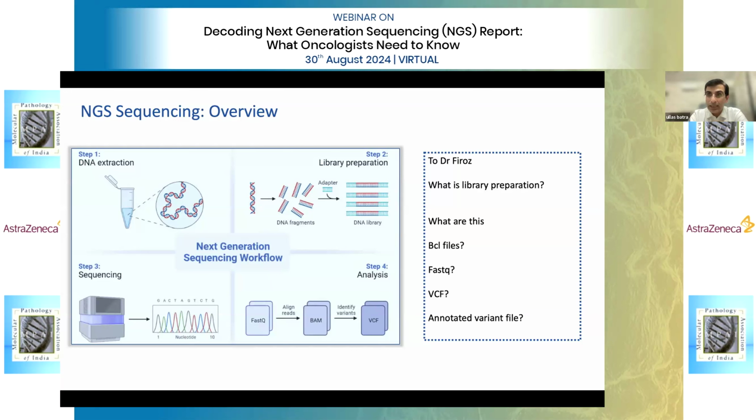From a clinician's point of view, sir, when I send for NGS, if it's a single gene, KRAS or BRAF, I can send a single gene assay only. The entire point of sending an NGS panel is that I want to actually look at some fusions also. True. So there are cases of NTRK, which is a fusion, which is not really a mutation. There are cases of RET in that. HER2/neu also can come. So correct me if I'm wrong, there's more of a learning also. Should we be doing both, and how much extra does it take to do both RNA and DNA?